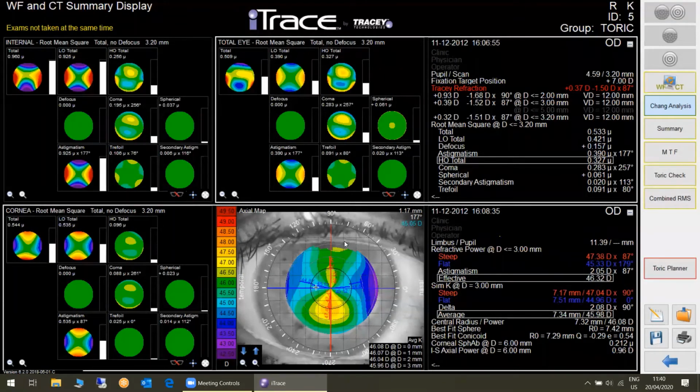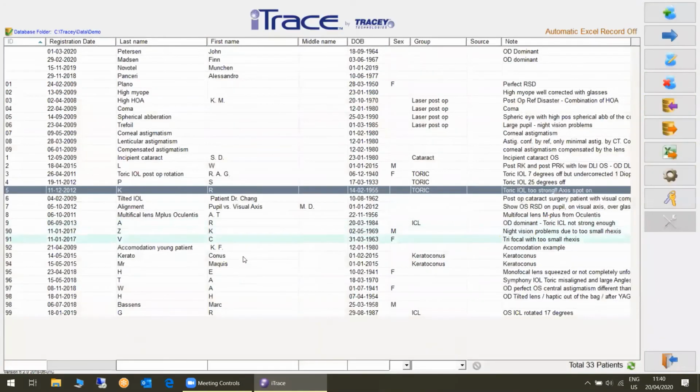I can dilate the pupil. It doesn't cost me anything. I can look with my slit lamp. I go to internet, www.astigmatismfix.com, and I find it. And I don't have to buy a 50,000 euro system. Okay, now I'm going to some cases that will prove you different.